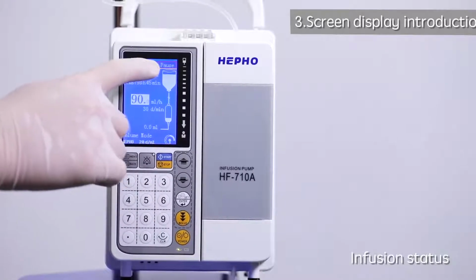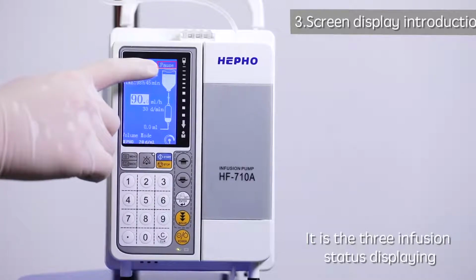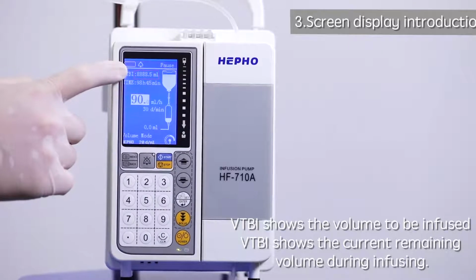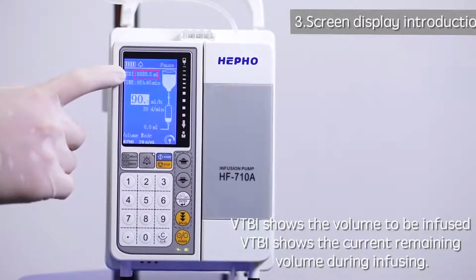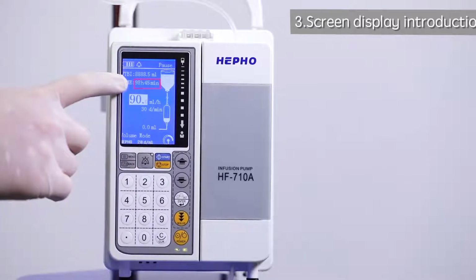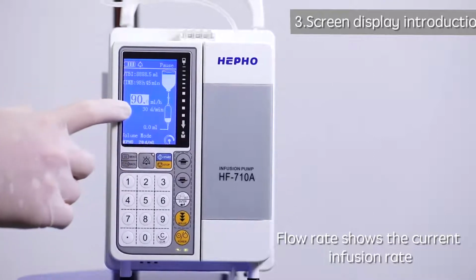Infusion status. Pausing, infusing, calibrating. It is the 3 infusion status displaying. VTBI shows the volume to be infused. VTBI shows the current remaining volume during infusing. Time shows the time required for the VTBI. Flow rate shows the current infusion rate.